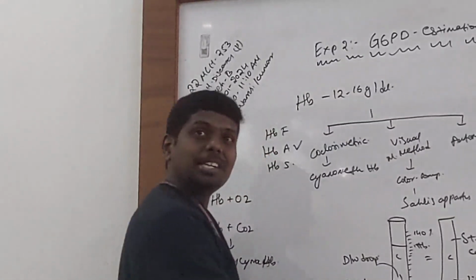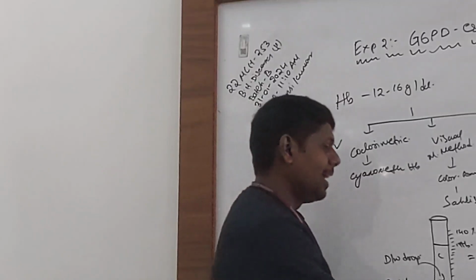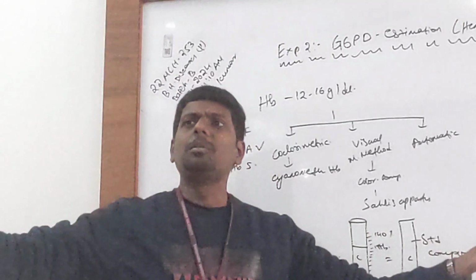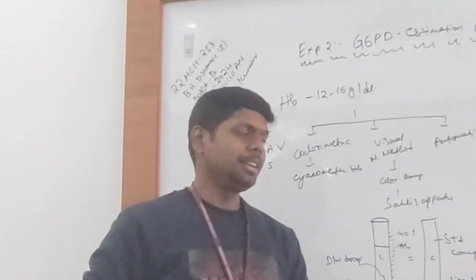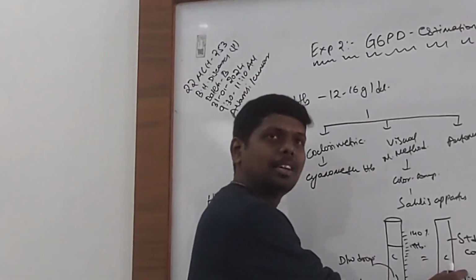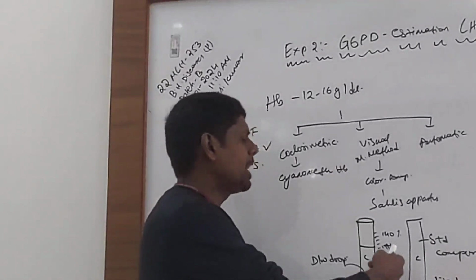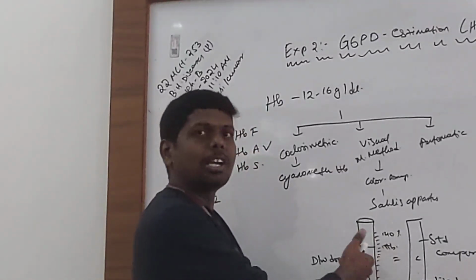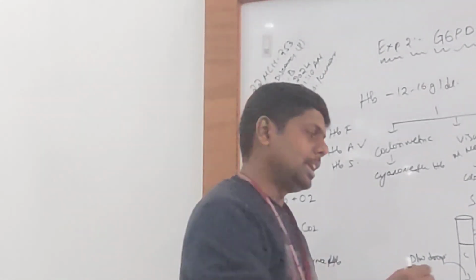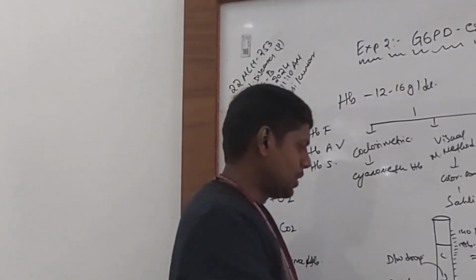So, this scientist did really interesting statistical standardization. How he standardized this color means he did pilot studies on multiple patients. Then he understood that a normal healthy hemoglobin must have this particular color. So he did some surveys and standardized this color. And we are just comparing our test with this color. Whatever level we get, that will be the hemoglobin level. Not so accurate actually. There are still some limitations, but this is easy. Cheap, easy to do.